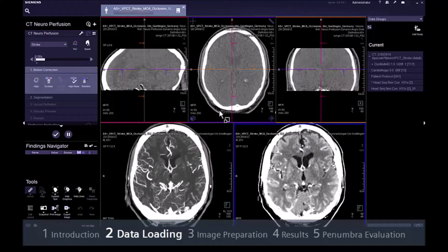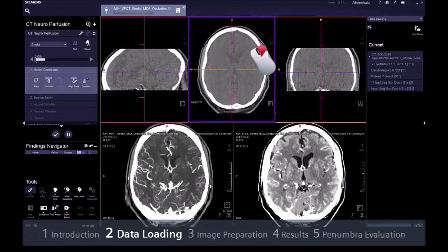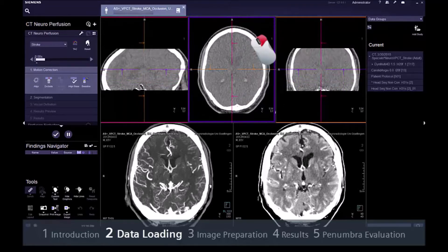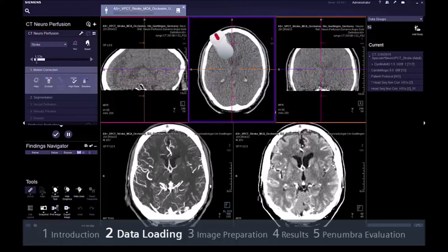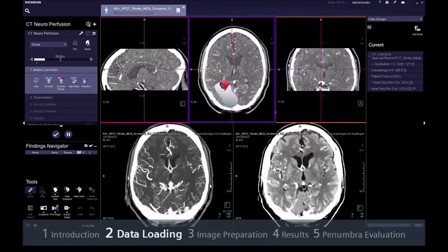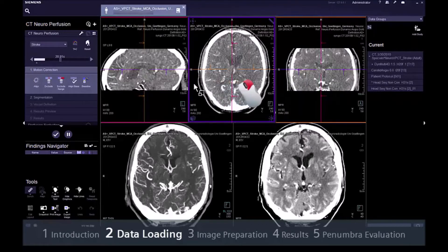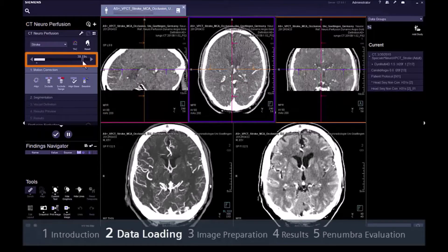Navigation can be done in any of these segments by pressing the right mouse button and dragging the mouse vertically. Window corrections can be done by pressing the middle mouse button and dragging the mouse vertically and horizontally. To navigate through time, use the upper segments and drag the mouse horizontally while pressing the right mouse button, or simply by moving the time slider.